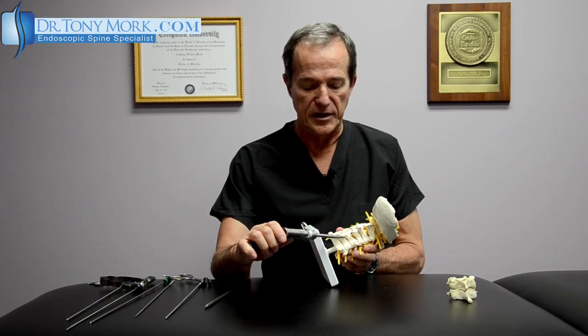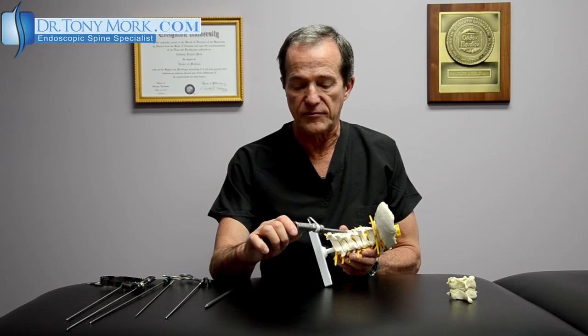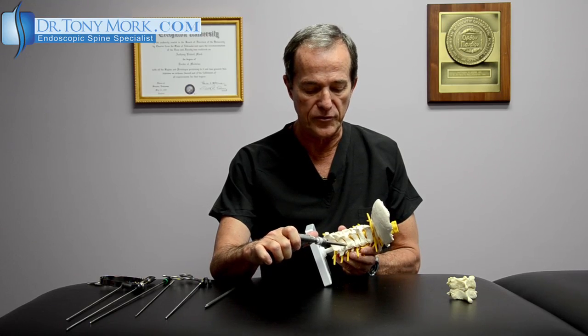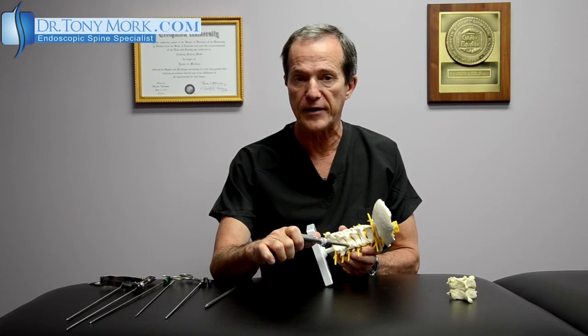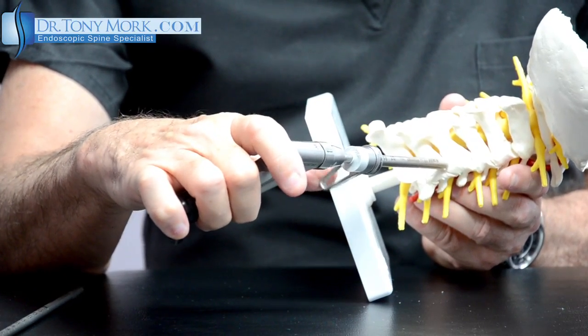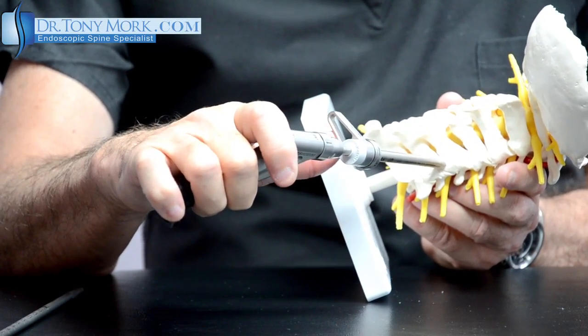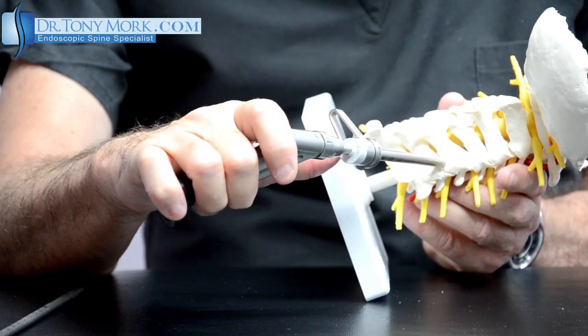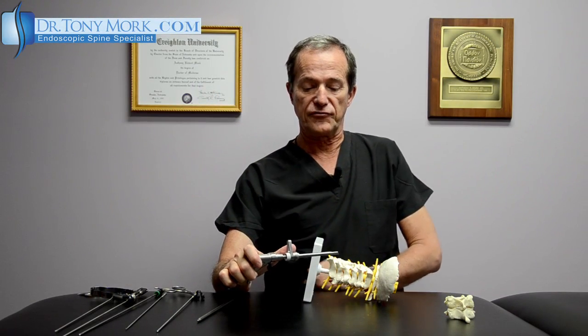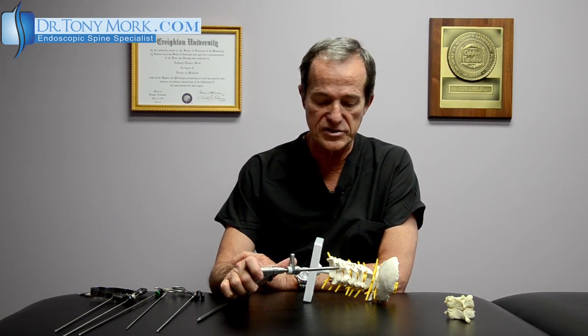It can be seen that using an instrument about five or six millimeters in diameter, with the appropriate equipment, we can get down to the foraminal canal and actually remove bone around the nerve that's trapping it. Even disc fragments have the potential to be removed using this approach endoscopically. I think this represents a real advance in terms of the ability to do this type of surgery endoscopically without the use of a fusion.